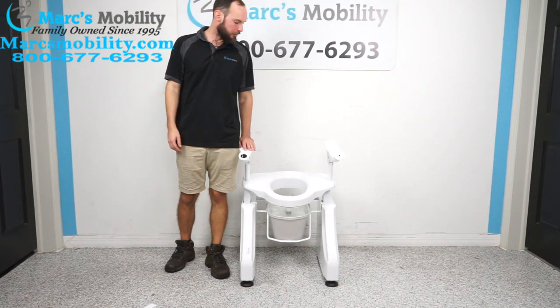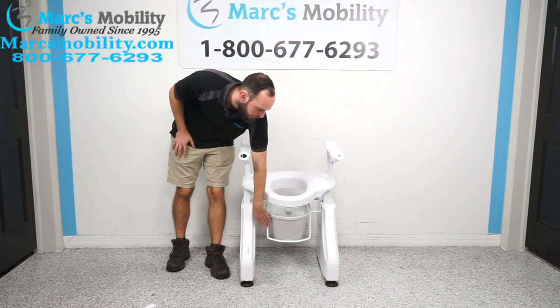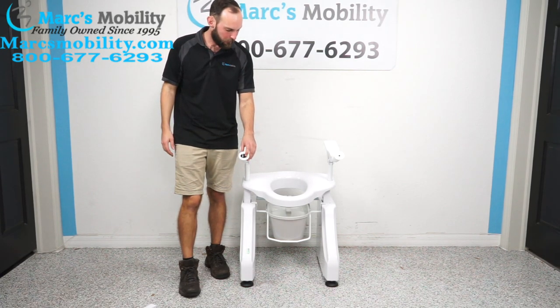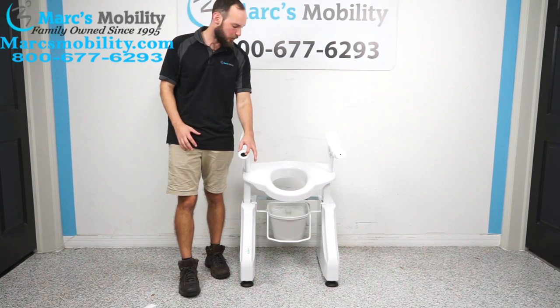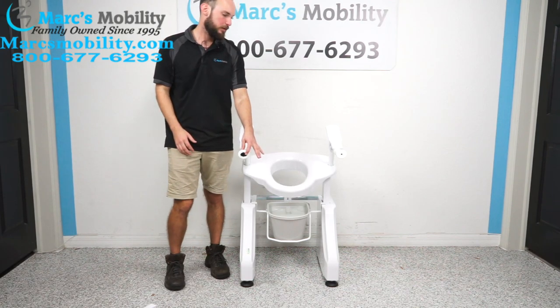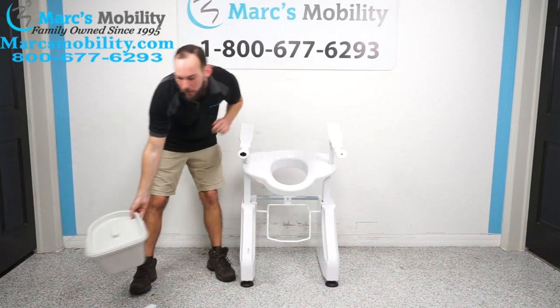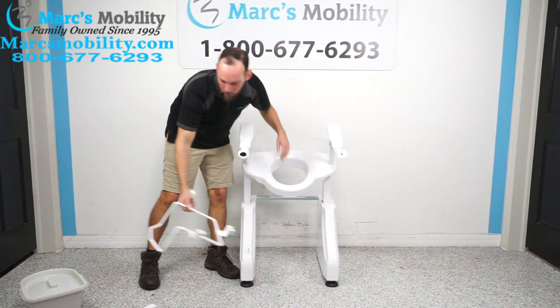The last thing this lift comes with is a commode pan down here in the commode pan holder. If you don't want that, you can just remove it. To remove it, you want to bring the toilet lift forward — this lift already comes with the battery installed, so it's just ready to go. Lift this out of the way and your commode pan pops right out. The pan holder will also lift straight up and out of your way.